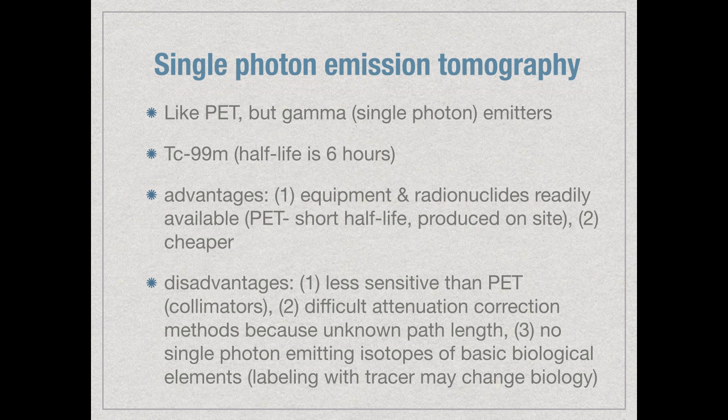So on the other hand is SPECT, single photon emission tomography. And some people put computed tomography, so there'd be a C, which makes it SPECT. It's like PET, but gamma emitters, it's a single photon. It's not a positron, it's a gamma emitter, it's a single photon.